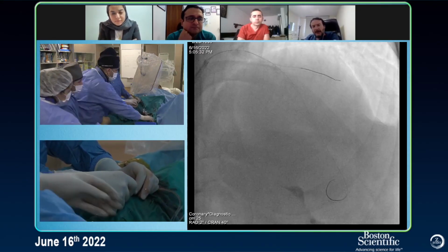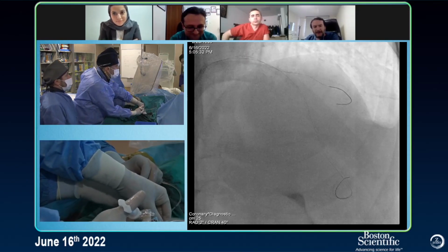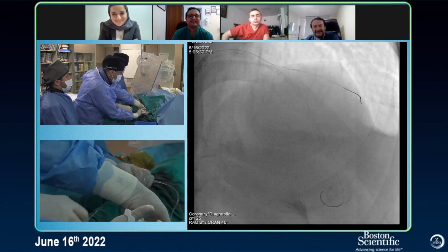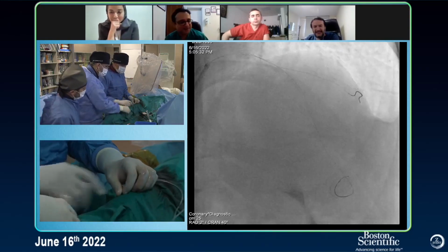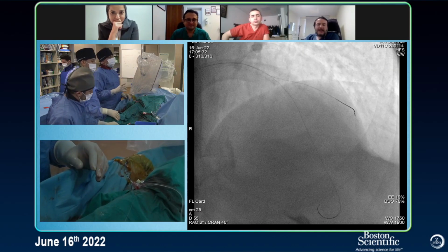So shake it. This was so easy. Yeah. So I don't know why you are wondering. No fun at all. You know, this was the easy one, that will look tricky, but it may not be. Let's do another one. Another wire. Or yeah, let's do another funny one.